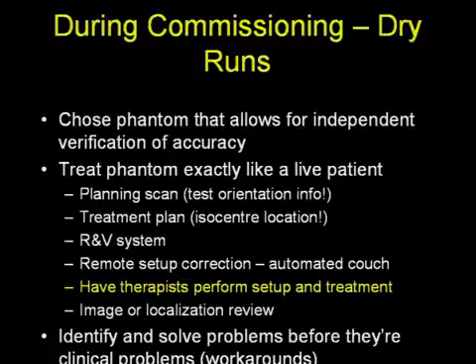Therapists often have valuable input that can tell the physicist what shortcuts or what could be potential ways to improve the efficacy and how fast the procedures can be done. So their input certainly is welcome.